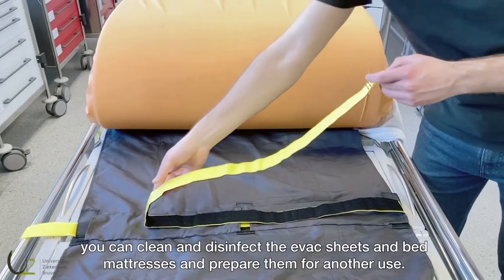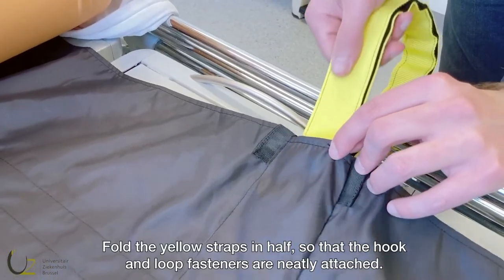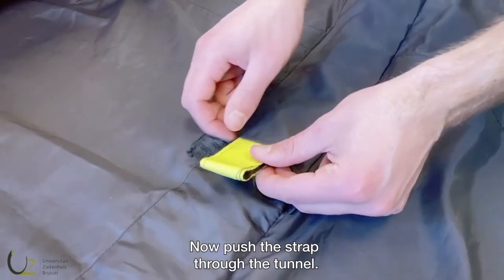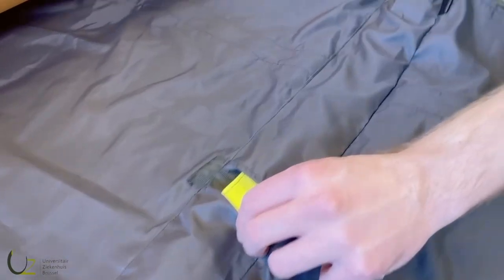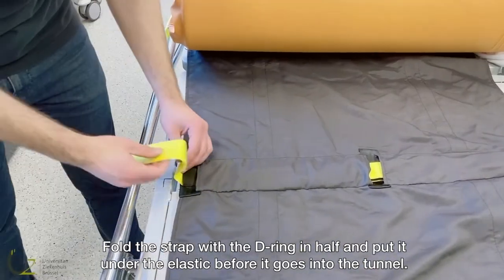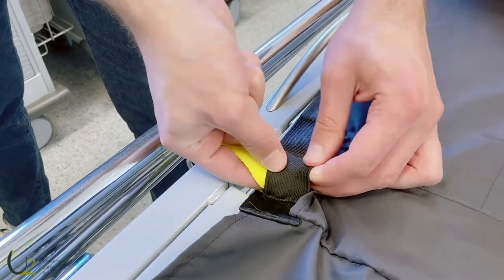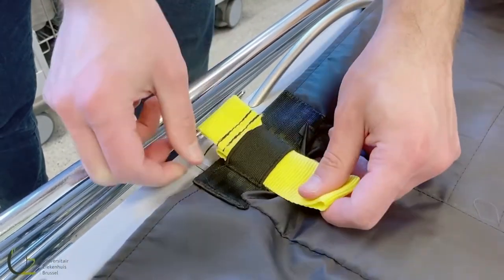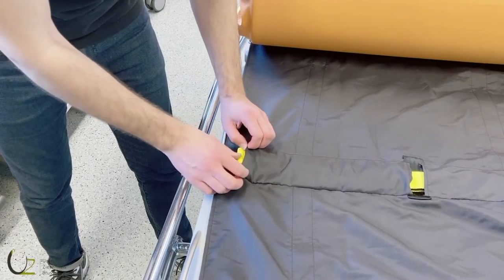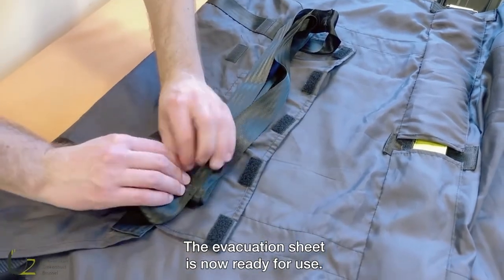After using the escape pod, you can clean and disinfect the evac sheets and bed mattresses and prepare them for another use. Fold the yellow straps in half so that the hook and loop fasteners are neatly attached. Now push the strap through the tunnel. Fold the strap with the D-ring in half and put it under the elastic before it goes into the tunnel. Fold the pulling strap at both head and feet end and tuck it away in the pocket. The evacuation sheet is now ready for use.